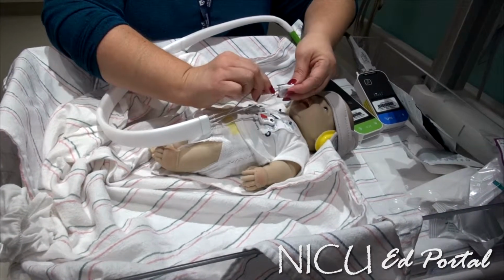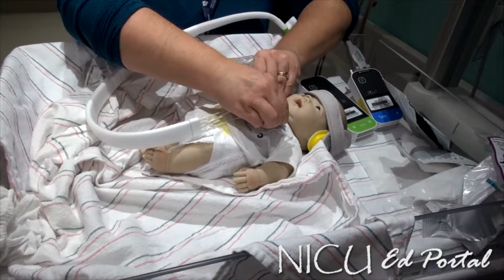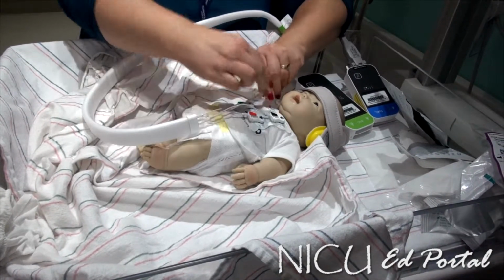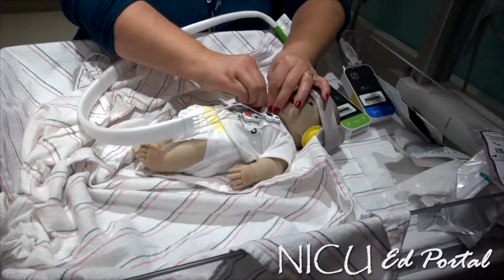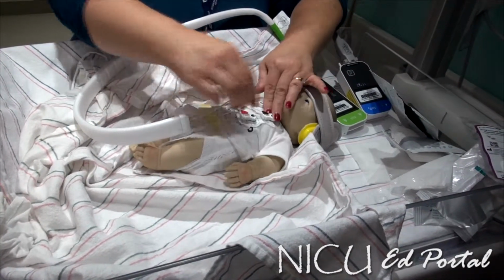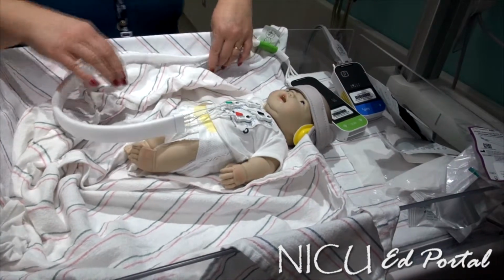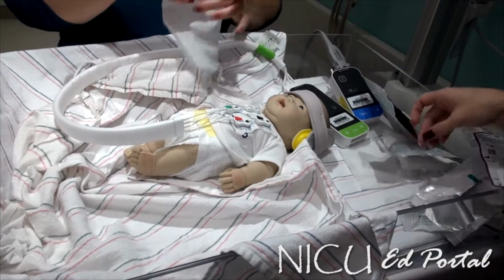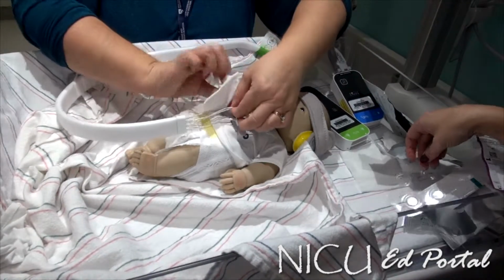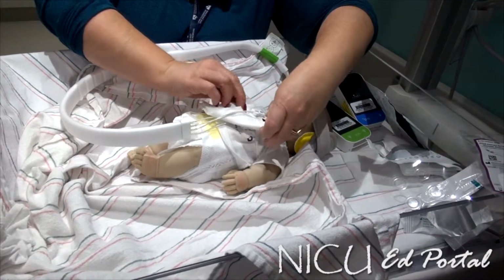When you're doing this, I know that I'm the one doing it, but I'm just telling you why I'm doing it this way. We try really hard to make sure that these all are straight and aren't all bunched. Some people will actually also apply them before they put the electrode on. Either way is fine, as long as you're not pressing on the baby. And then we always put gauze between the layers because we just want to be certain that there is no possibility of the wires touching the skin.